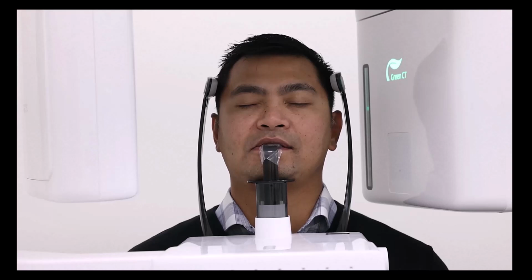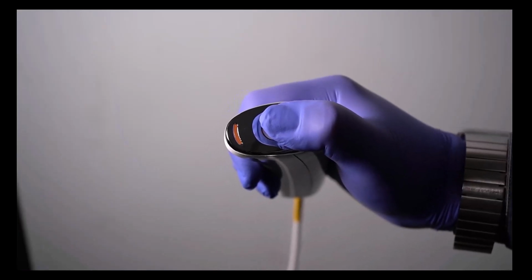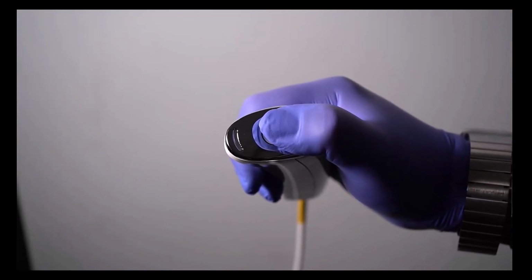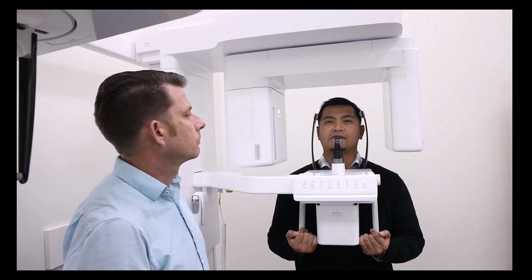The system is ready to capture an image. Please close your eyes until image capturing is complete. Image capturing is complete. Please wait a moment. Please open your eyes and follow the operator's instructions.